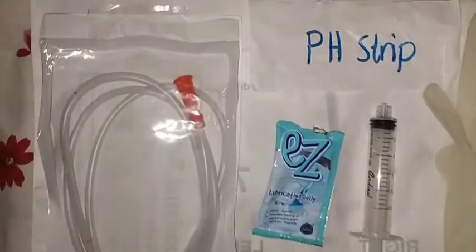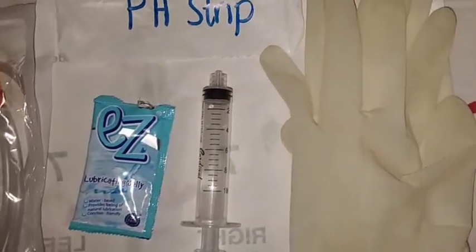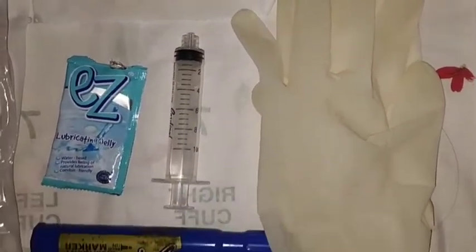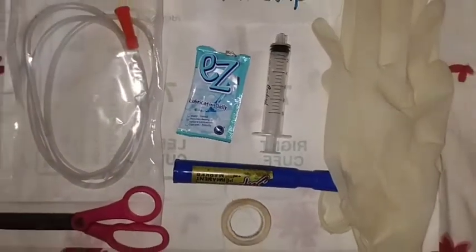Planning. Identify the availability of needed supplies and equipment. Arrange for extra nursing personnel to help as necessary. Prepare equipment and bring preparation to the bedside.